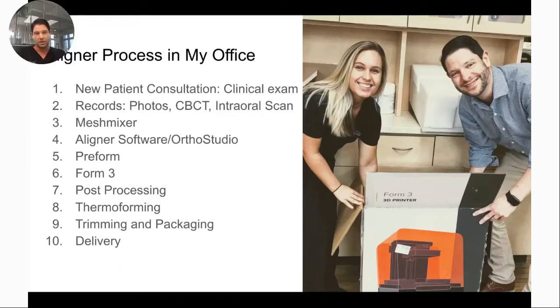And that's really where things start to separate from normal orthodontic office flow. At that point, the STL files generated from the intraoral scan are usually uploaded to Mesh Mixer, where we can do some adjustments, clean those models up, and then import that into whatever aligner software you use. I use Ortho Studio.